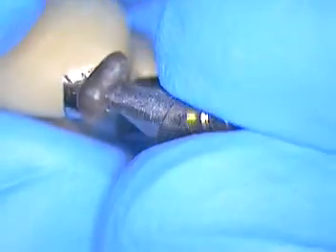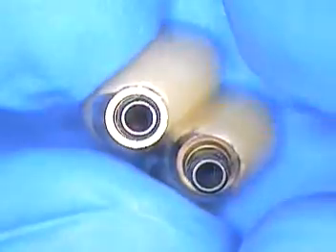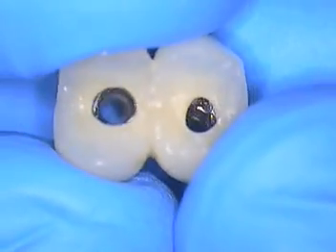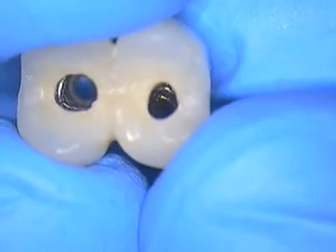So here's the abutment. We'll tighten this one down today, hand tighten them both. I'll tighten this one first and then we'll fill this in with two plugs that will go in here. And that's where we'll end up today.